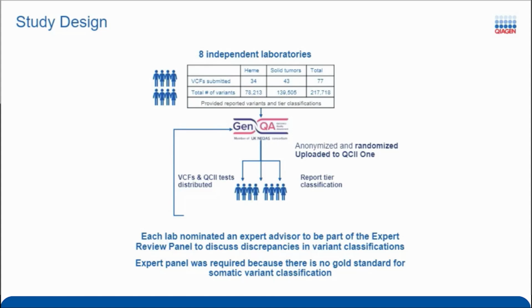Yeah, and something also important to point out is that this particular tool combines this automated method with a person sitting behind it as well. Not that they're doing the full report. At the end, that's the end user's job, but it can provide confidence in what the output is and what the suggested call might be.